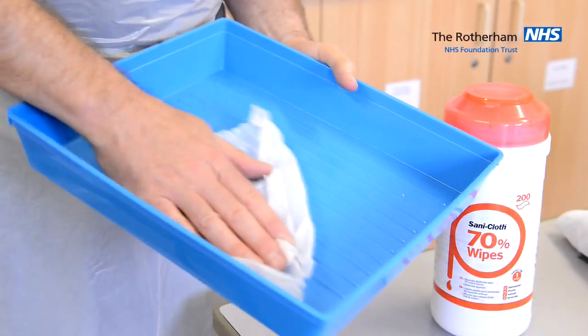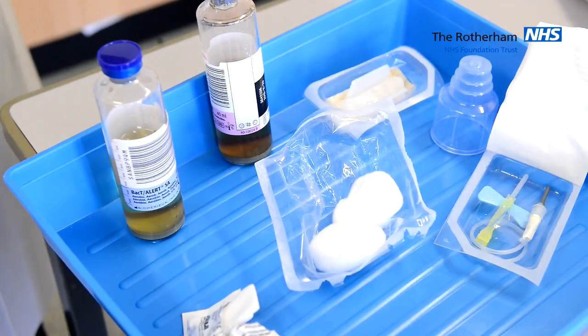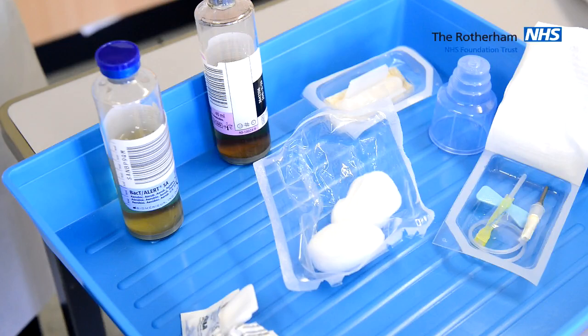First of all, we prepare the tray. Prepare your equipment and utilise the packaging to maintain the sterility of the equipment.